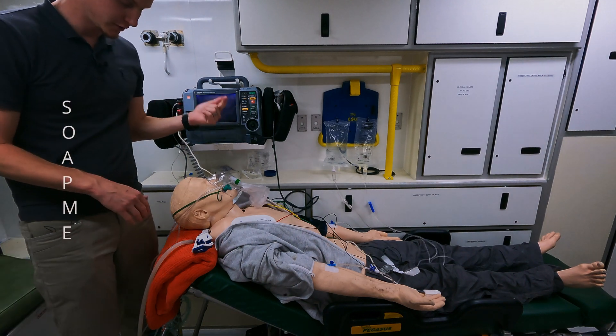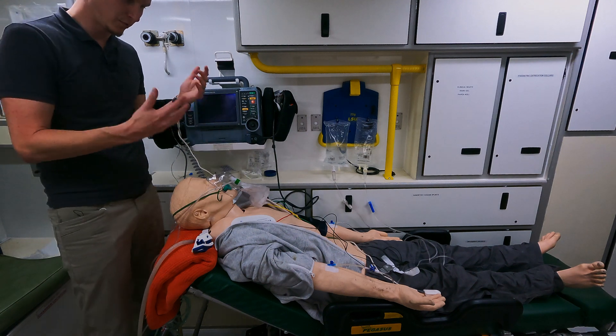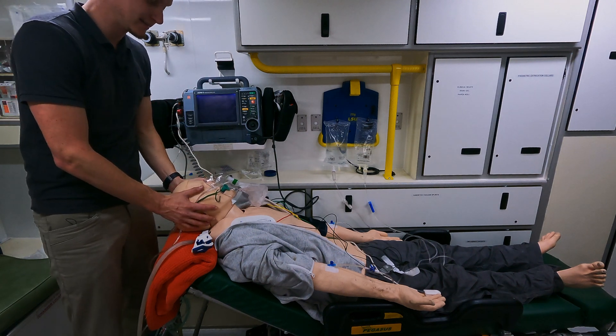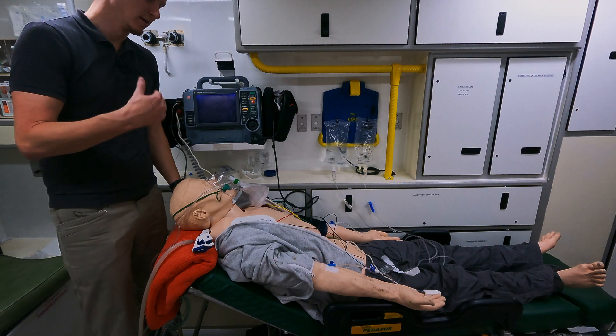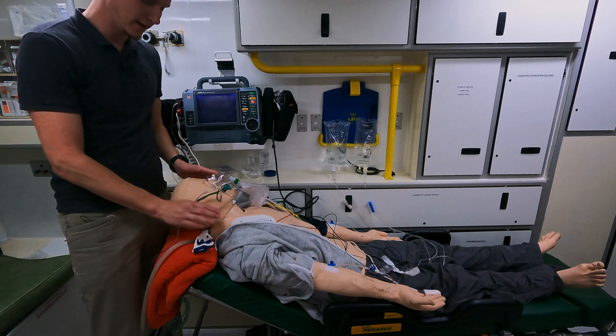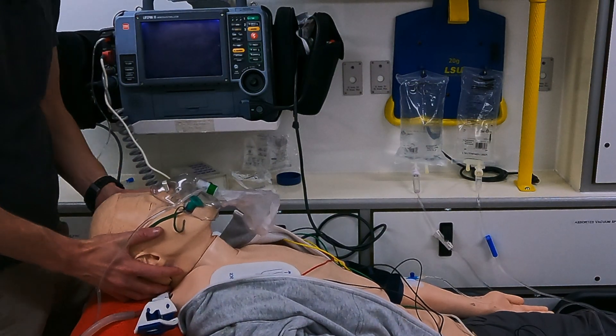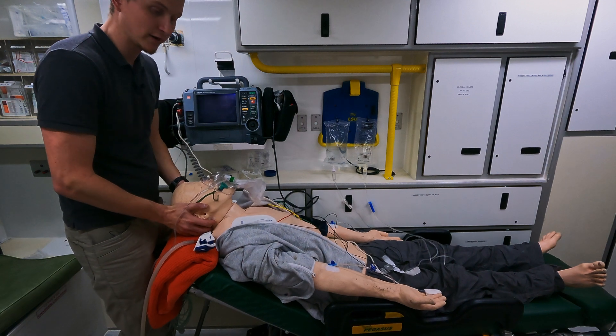Now P is for position or preparation. As you can see, the patient is positioned correctly. It's a non-trauma patient so we're not worried about C-spine — we ramp them up with the ear above the sternal notch, face flat with the ceiling. That's exactly what I've done here, so he's in the correct position.